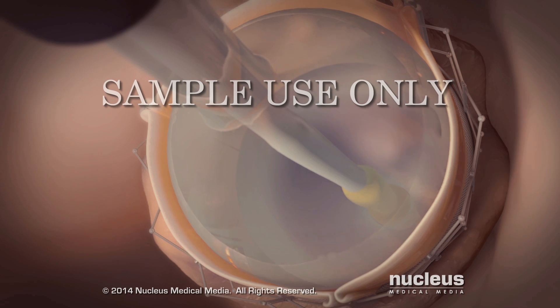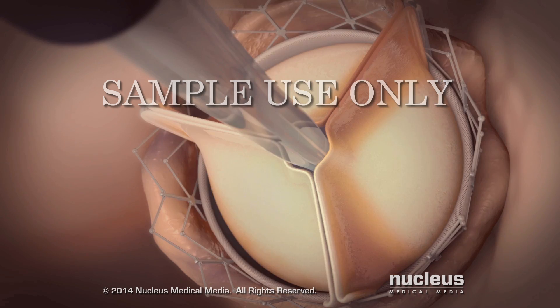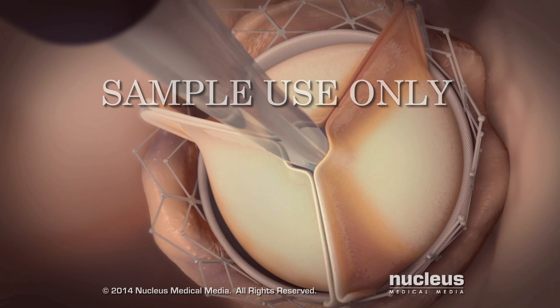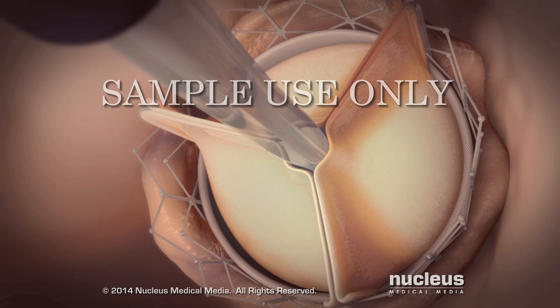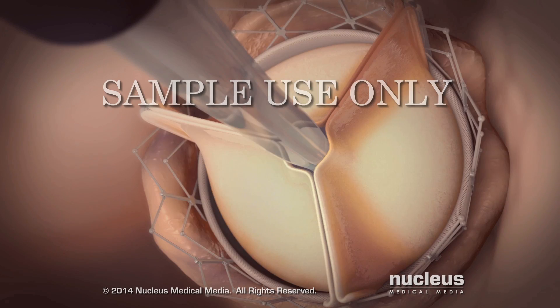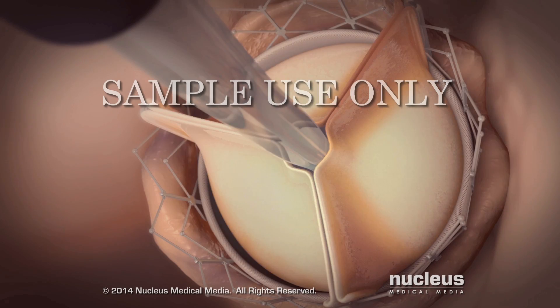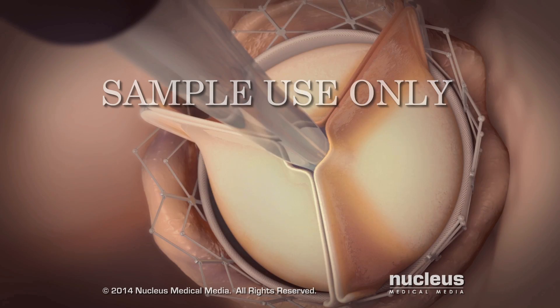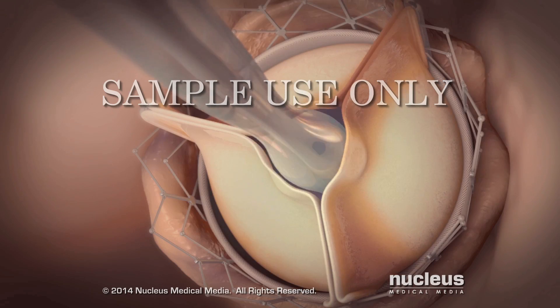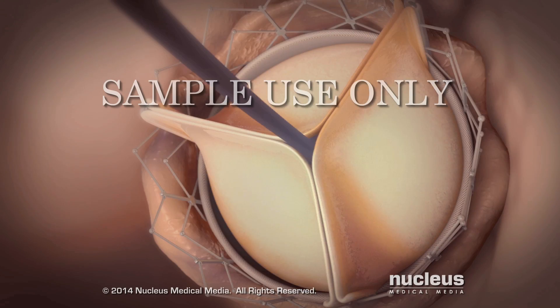After placement of the new aortic valve, your surgeon will deflate the balloon. The stent will support and secure the replacement valve in place. The catheter and guide wire will be removed.